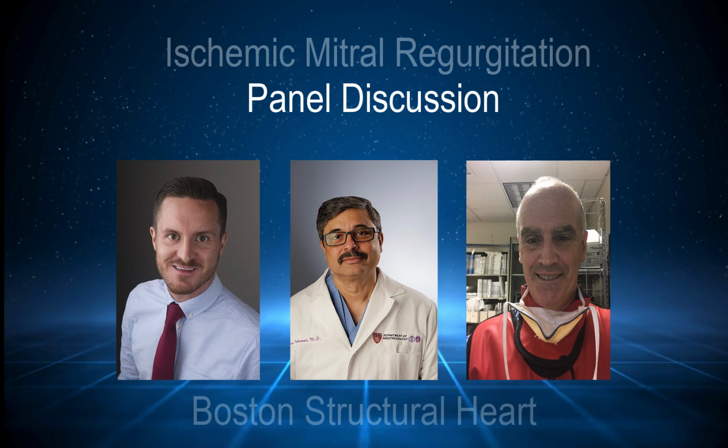Each way has its pitfalls and advantages. Using EROA, 3D vena contracta, as you said, in patients with AFib where you have poor temporal resolution, you may only be analysing 2 frames, so it's not very useful there. Whereas we all know the pitfalls of using 2D vena contracta.